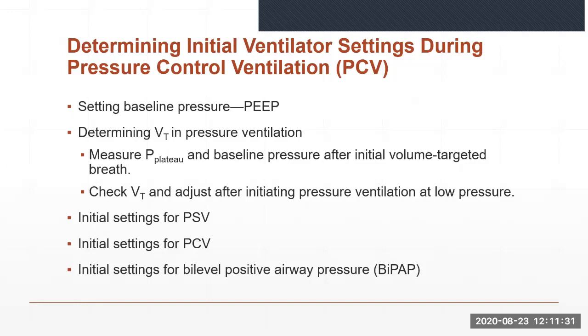The pressure limit must be set because in some ventilators, pressure can be higher than the set pressure control level if the patient actively coughs. Low tidal volume and high frequency alarms are also necessary.